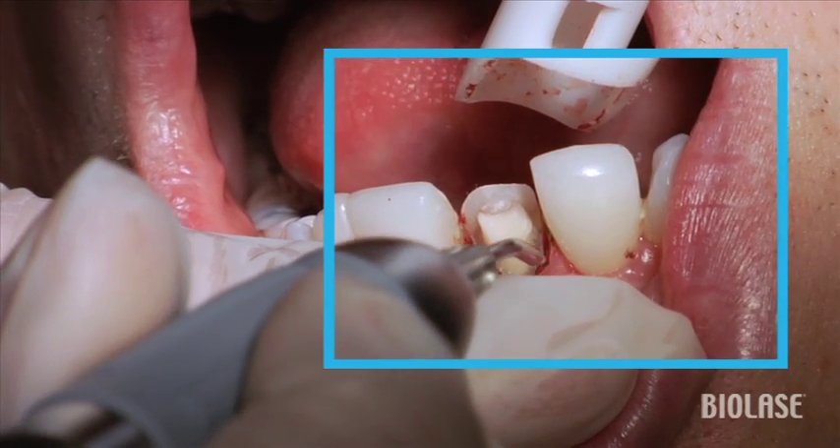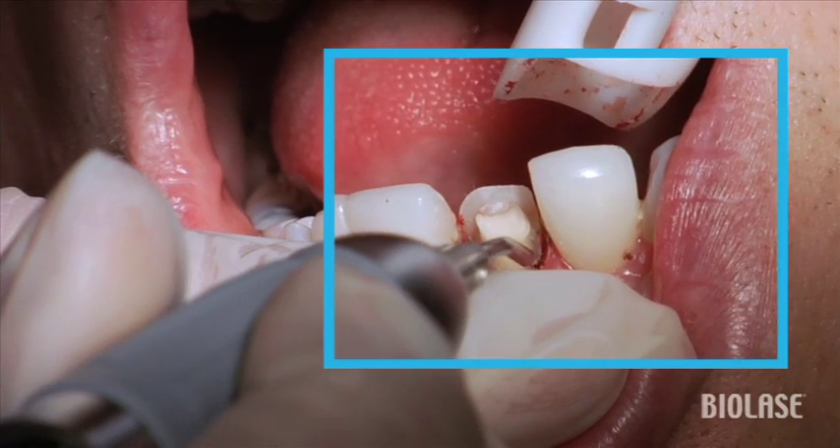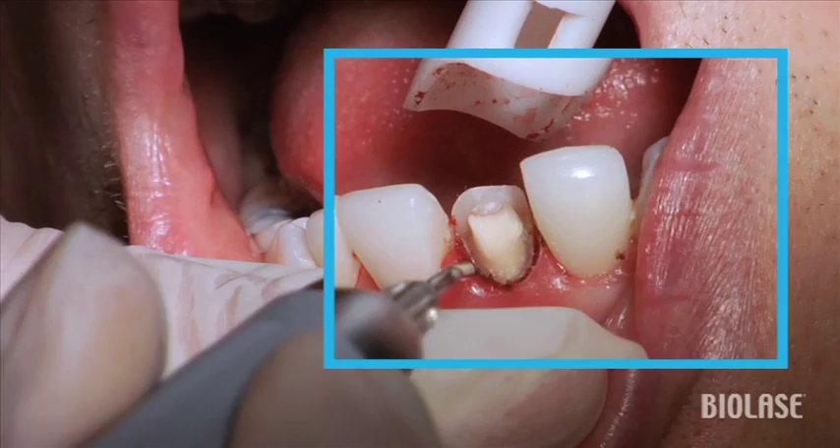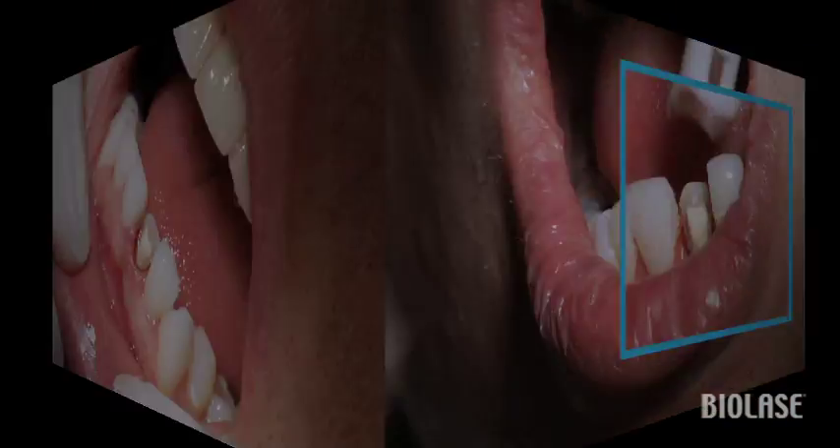In case you're wondering why there's some bleeding here, it's because after the patient dislodged his veneer, the tissue became quite inflamed. But that's one of the benefits of being able to use a diode laser rather than cord.